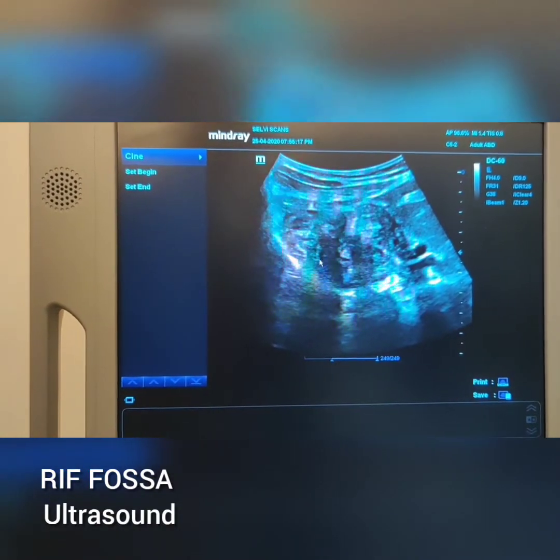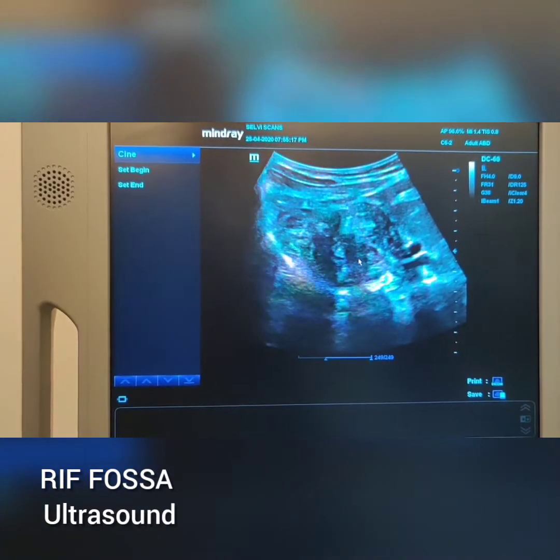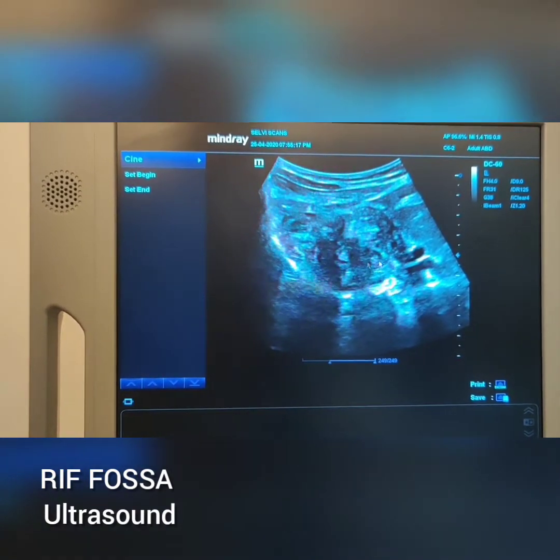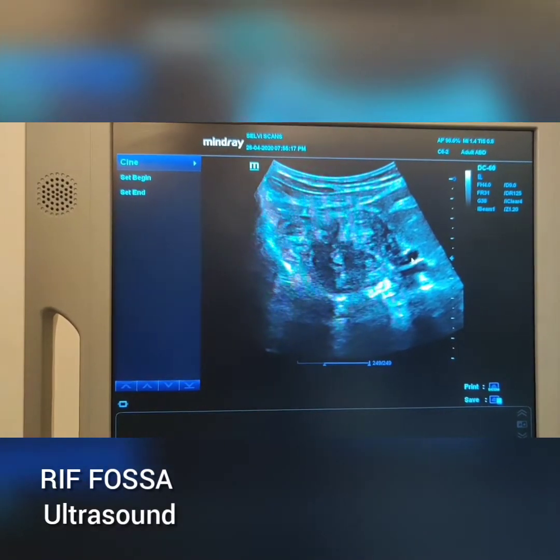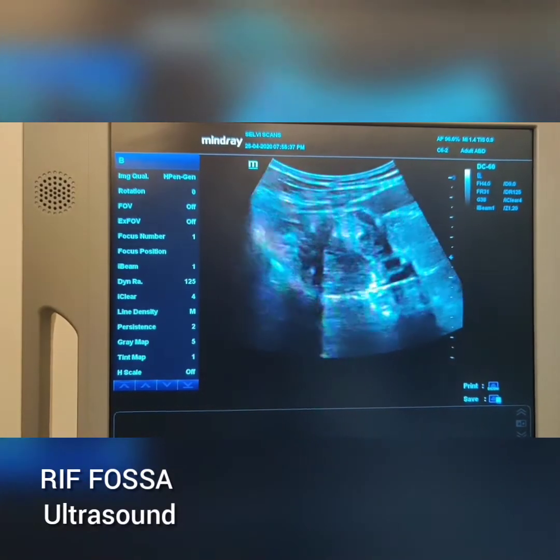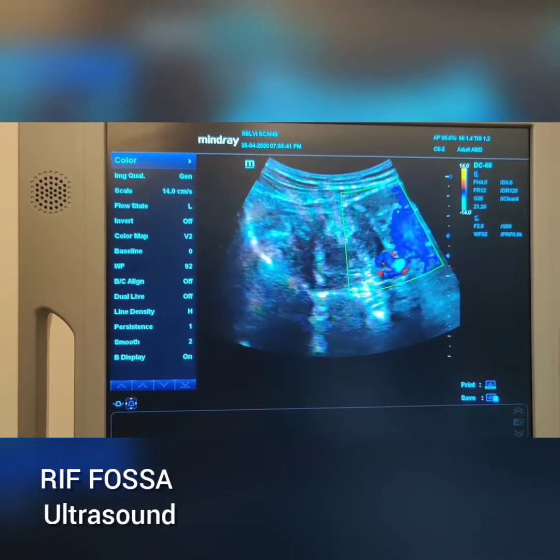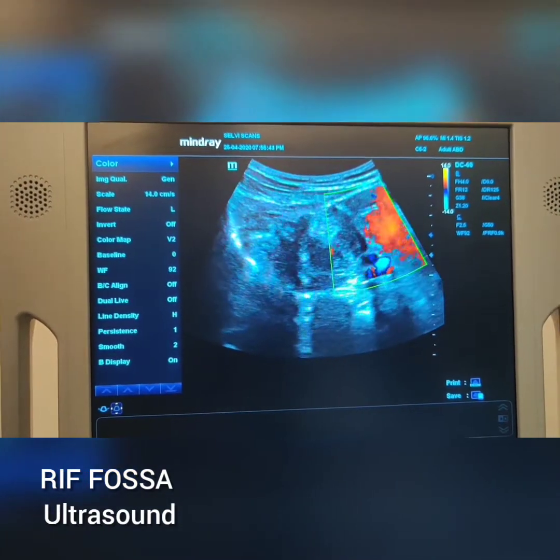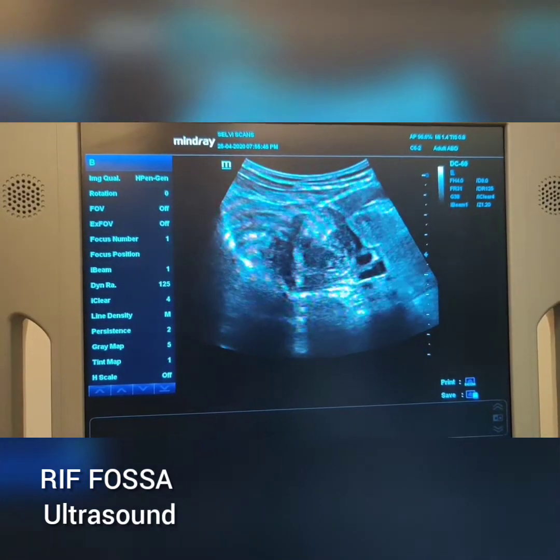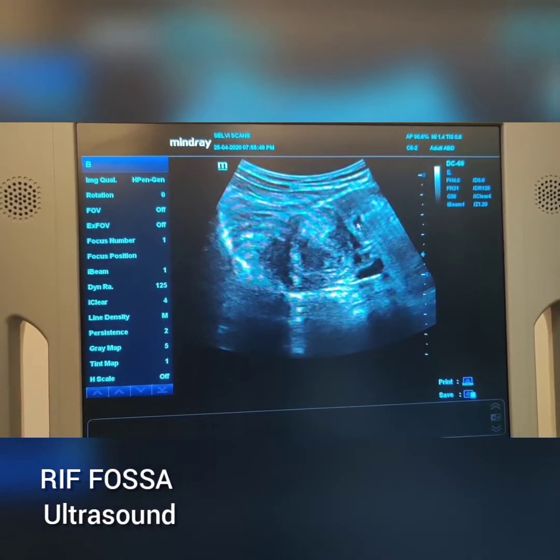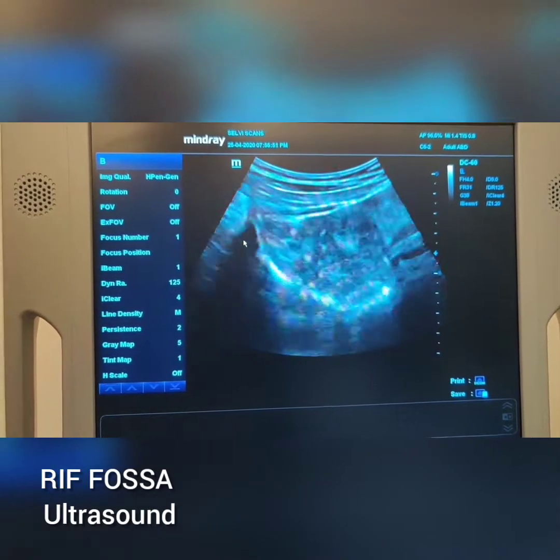This mixed echogenic lesion that you're seeing looks like an abscess — mixed echogenic. That is the iliopsoas muscle. Then the anechoic structure you're seeing is going to be the iliac vessel. I'm just putting the color on to show you — that is the iliac vessel with color pickup. You can clearly see that is the iliac vessel, and that is the iliopsoas muscle. This is going to be the iliac crest.